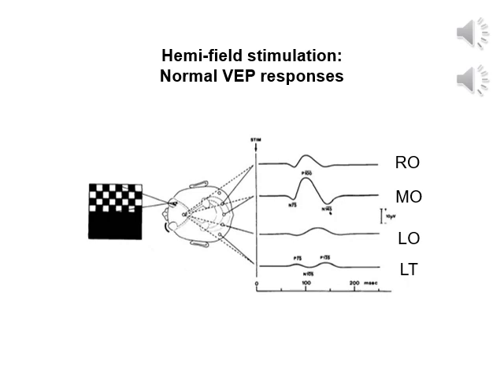This left retinal field of the right eye is also called the nasal field of the right eye. An activation of nasal fields cross over at the optic chiasm. So in this case, we have a right visual field checkerboard activating the left retinal field of the right eye, and that activation travels down the right optic nerve and crosses over at the optic chiasm. This then passes into the left hemisphere and travels to the left visual cortex.